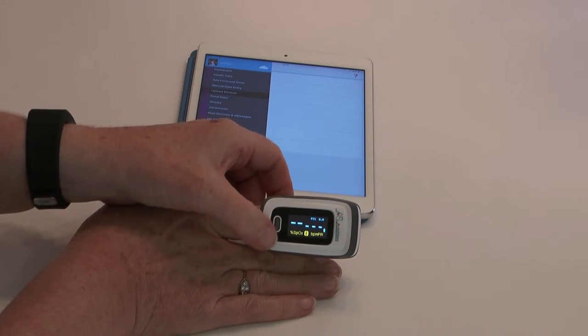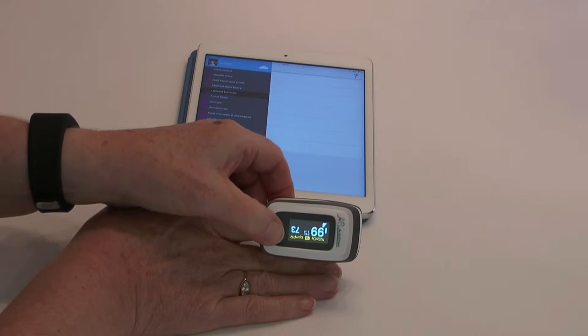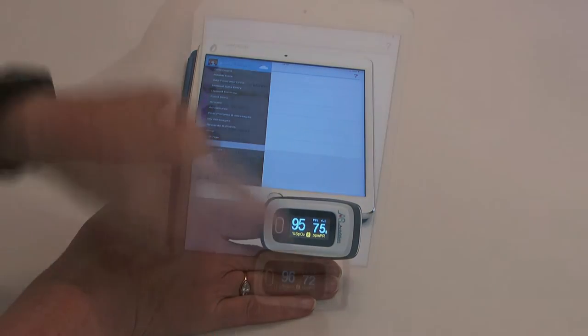You can adjust the orientation of the screen by pressing the button on the top. The pulse oximeter also indicates when it is paired, alternating with the battery charge symbol.